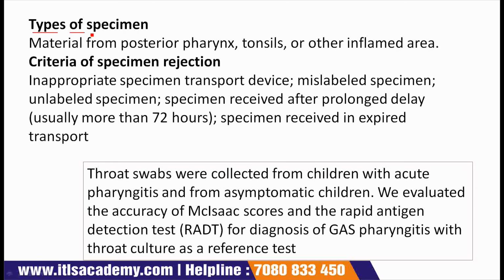Types of specimen: material from posterior pharynx, tonsils, or other inflamed area.